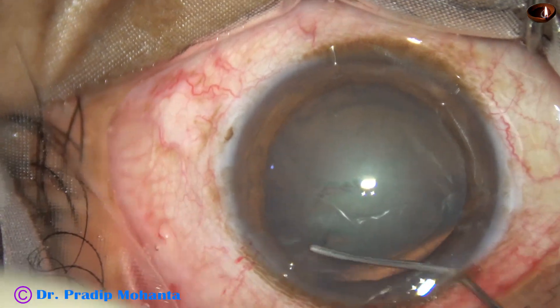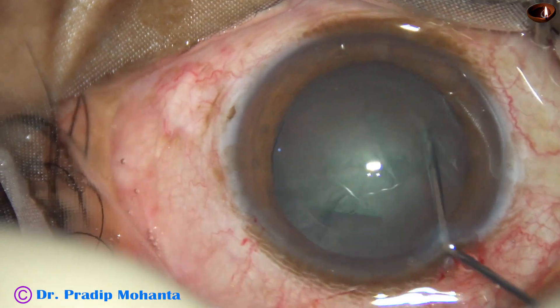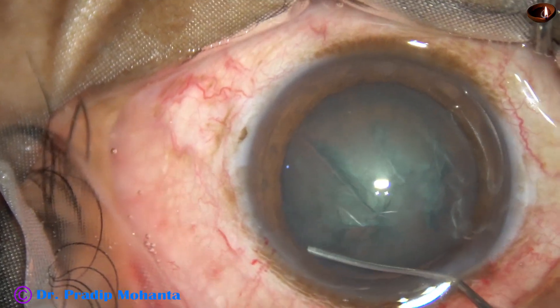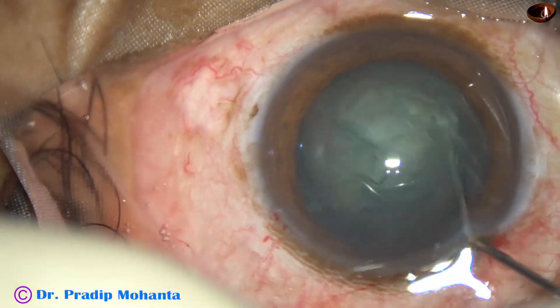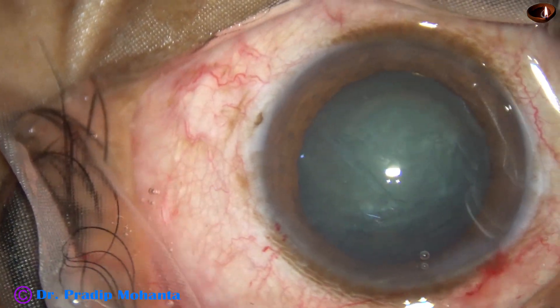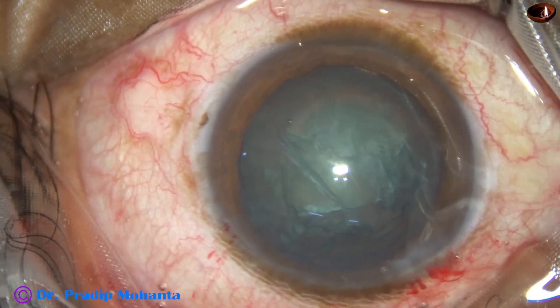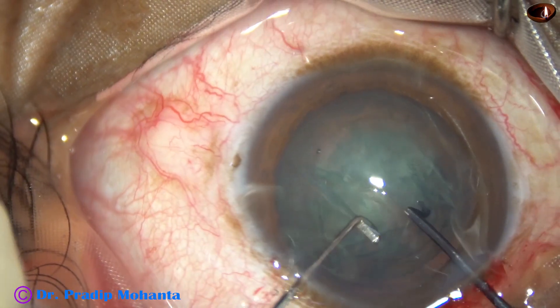Hydrodissection is done with the help of a 27-gauge cannula and BSS. In this case, nuclear rotation was not satisfactory. But when we use pre-chop, nuclear rotation is not that important. In this case, I am using a pre-chopper invented by Dr. Sohel.